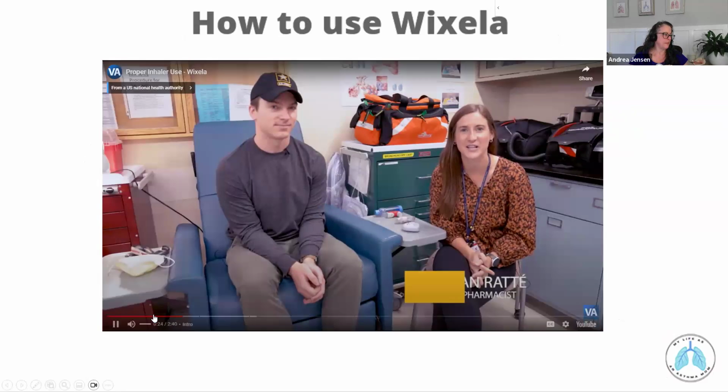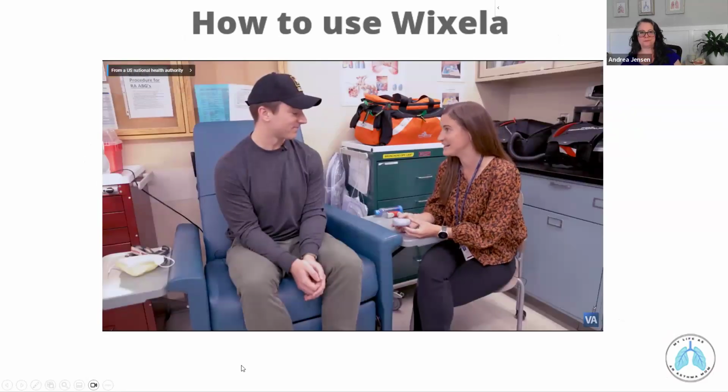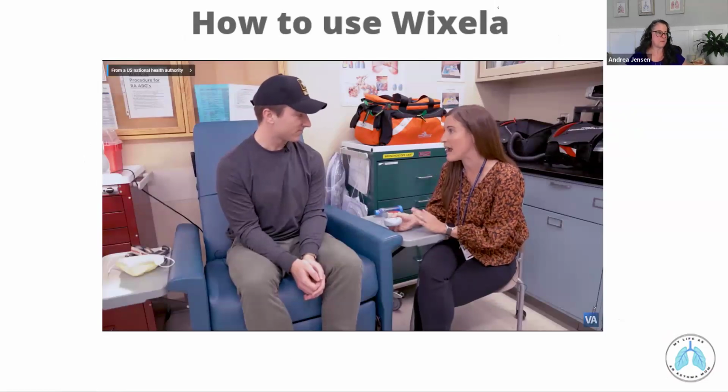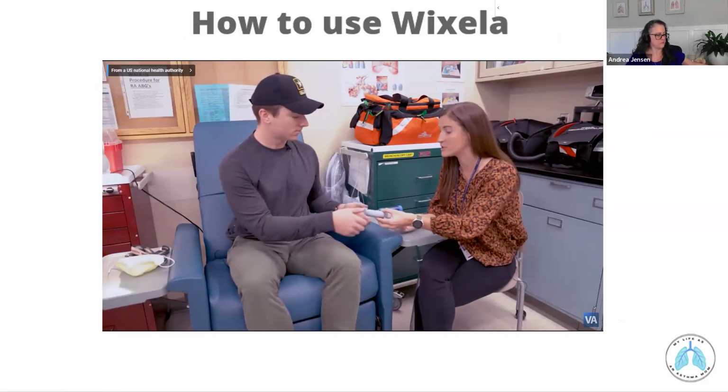Pharmacist here at the Salt Lake VA. Today we're going to go over you were prescribed Wixela. Okay. This is an inhaler used for asthma or other chronic obstructive pulmonary diseases, also known as COPD. Okay. I'm just going to hand this over to you and walk you step by step how to use it.